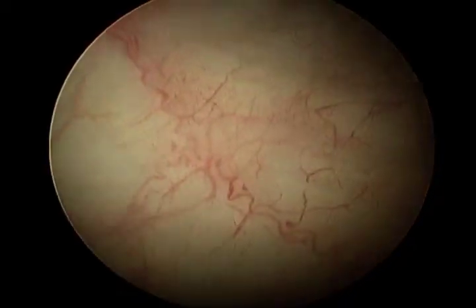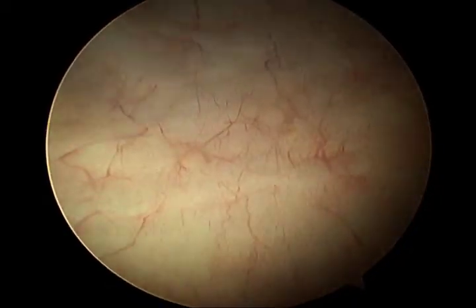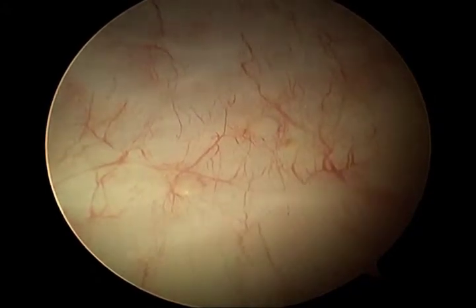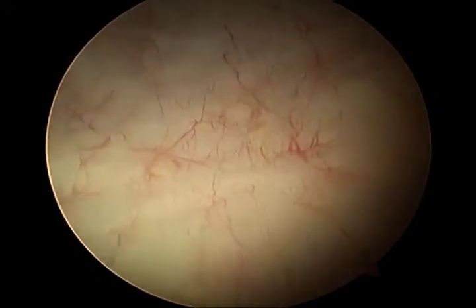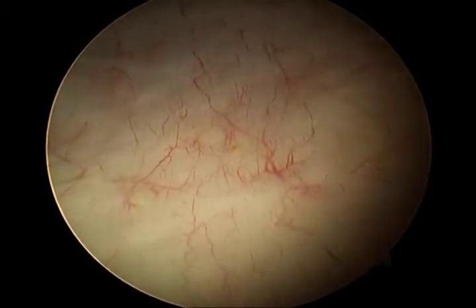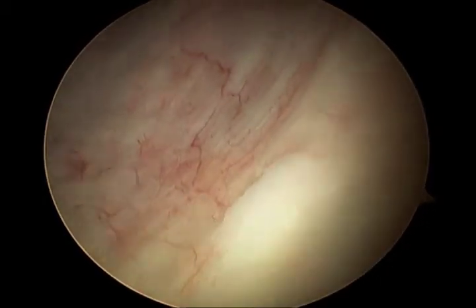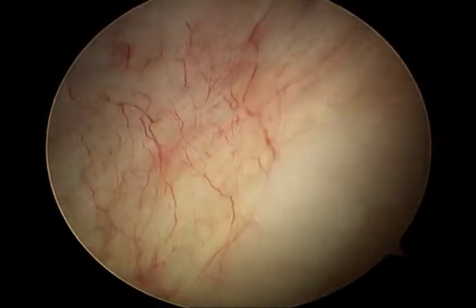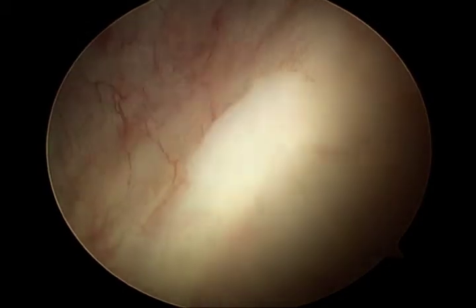These can include plaques, which can be associated with bladder infections, or cysts, which may be opaque. An opaque cyst is referred to as cystitis glandularis. The cause of this cyst should be determined. Oftentimes this may be because of recurrent bladder infections. However, if the reason for the appearance of such a cyst is unknown, a biopsy may be warranted.